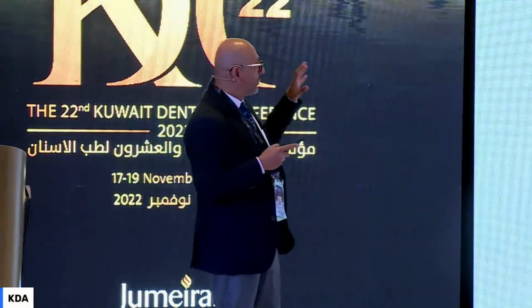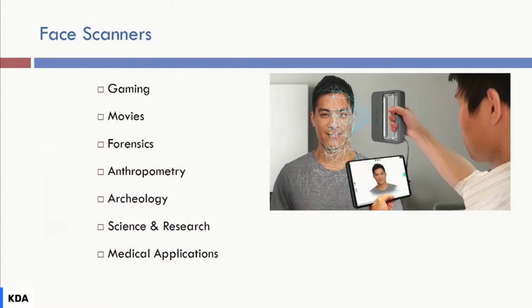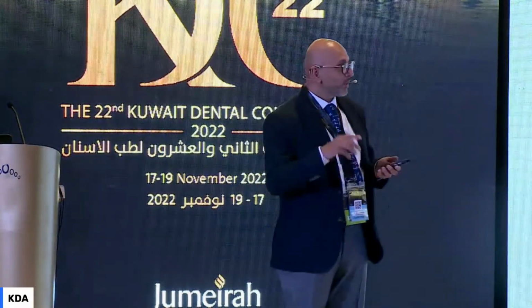All right. So specifically, I'll be talking about facial scanning, and how it's used in maxillofacial surgery. Three-dimensional facial scanning is considered a new technology. We've been doing a lot of imaging using conventional X-ray imaging, such as OPGs, lateral ceph, and CT scans, and we've been relying on hard tissue analysis in order to decide what we want to do for our patients in terms of correcting dentofacial deformities. But now, with the advent of recent technology, we can use facial scanners to look at the soft tissue and plan from the outside in. So try to go to the goal.